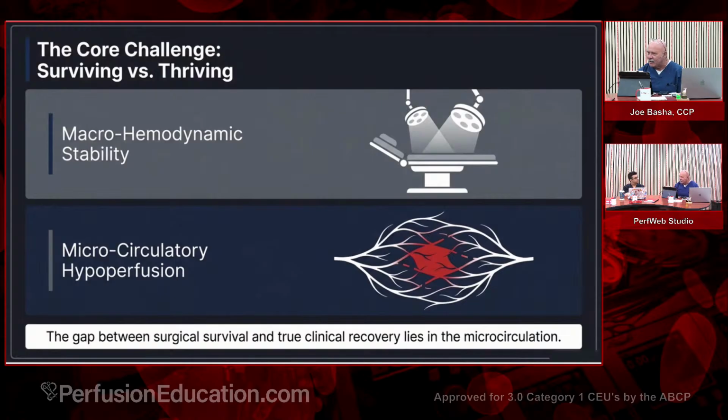A lot of this is measuring that end-tidal CO2 coming out of our oxygenator. I have some stuff on that to explain it a little better, but it has to do with cellular respiration and what you're basically expelling through the oxygenator. Sure. But historically, as perfusionists, we function in the macrocirculatory world, because it's harder to see the microvascular level without doing a lot of different things.